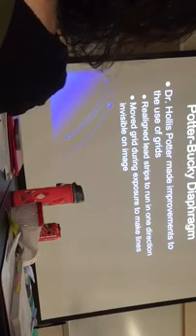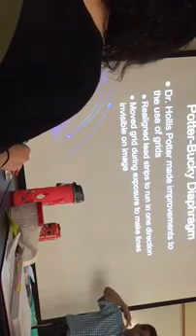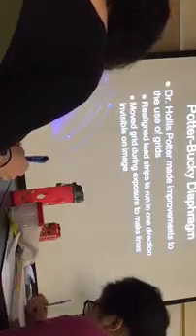All right, now this is important. The motion of the Potter-Bucky grid has to be within the exposure time that you're using. It has to move in less than or equal to the exposure time. If it's taking longer than your exposure, then you're going to have motion. Make sense? There are grids, especially the older type grids, that don't work well with new equipment, because with new equipment you can use a 1 millisecond exposure. Some of the old designs use a crank with a spring. They are not going to move at 1 millisecond.